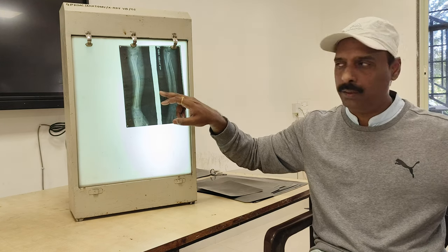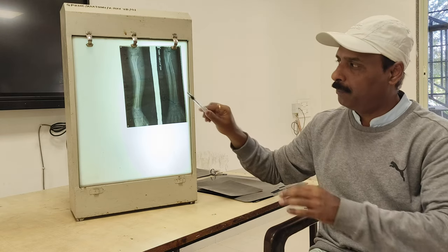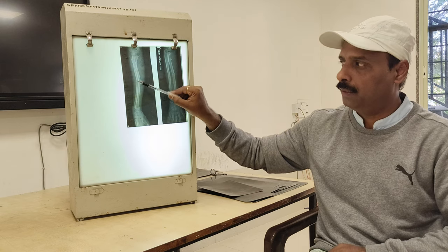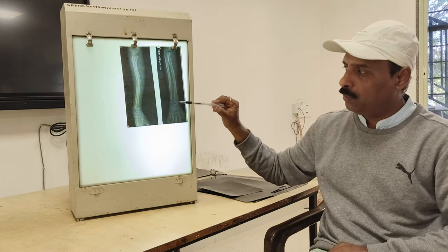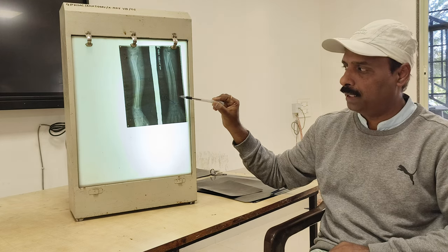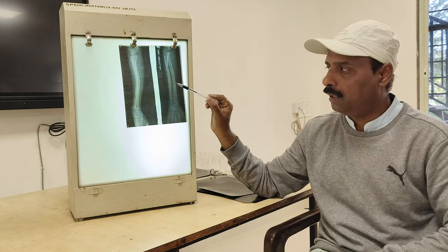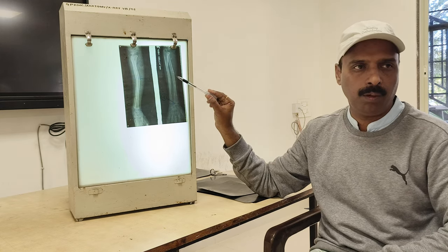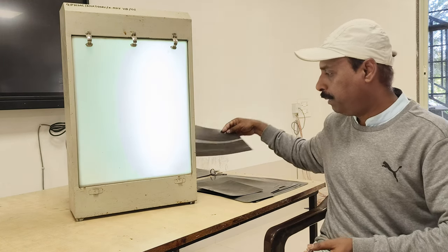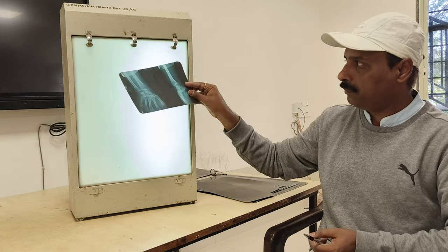You should remember this fracture line, the fracture of the radius and ulna. Other parts you are going to get at the lower end, like the styloid process, which you have to mention. So this is the lateral view and AP view of the forearm x-ray. With this we are covering the plain variety of x-ray.